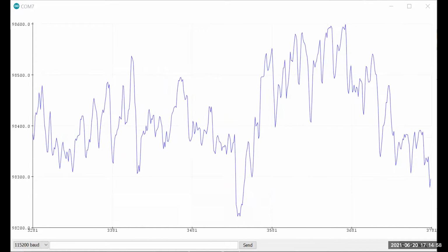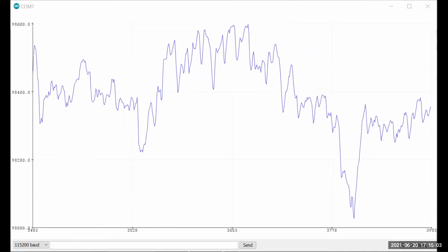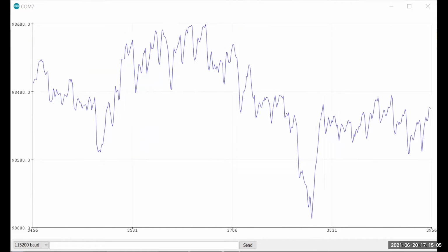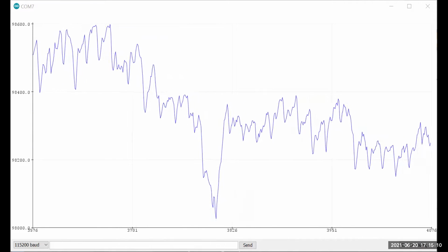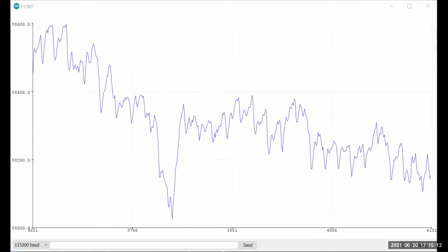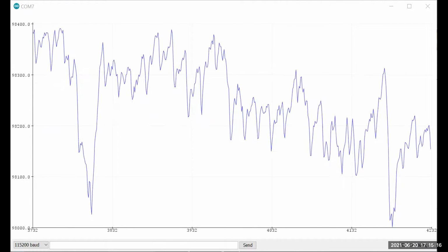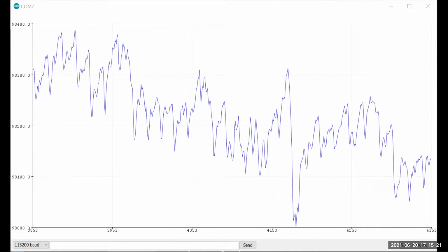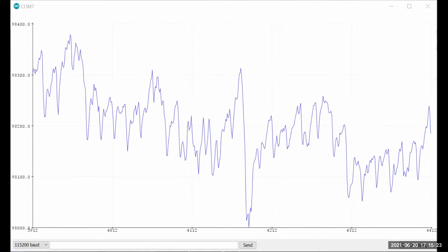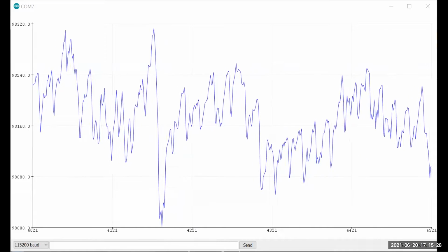I've been running mine for a while, and every time my heart beats, let me adjust my pressure of my finger. I will say that this sensor is very sensitive to how hard you push down on these sensors. So it's really critical you keep your pressure near constant. So you see that I have it go up and down and up and down, and it's going over and over again. Every time it does that rapid shift down, that's right when my heart pumps.